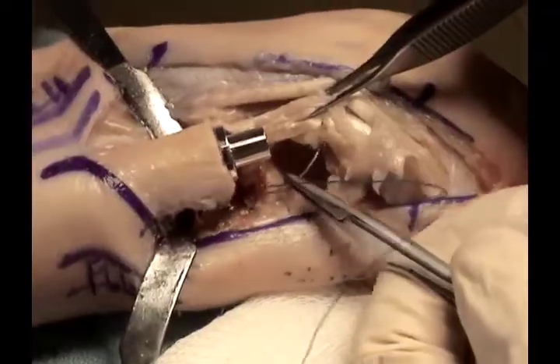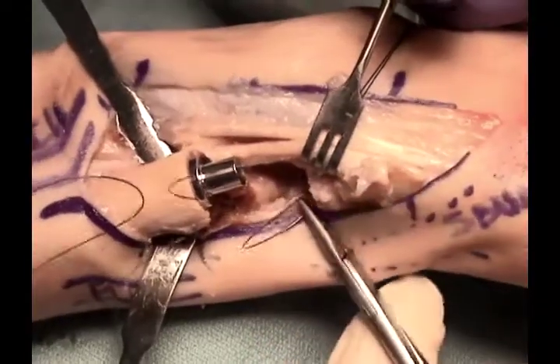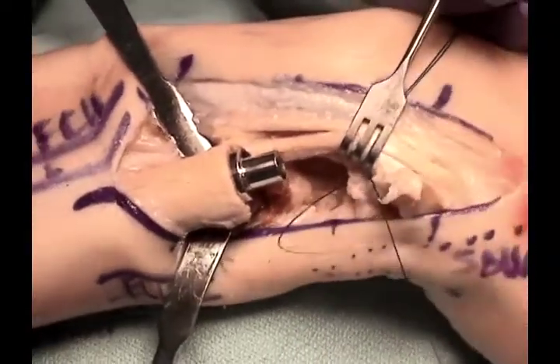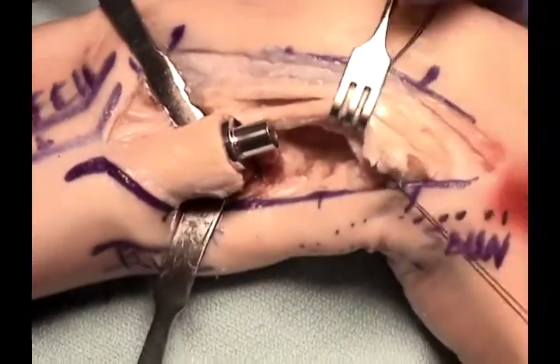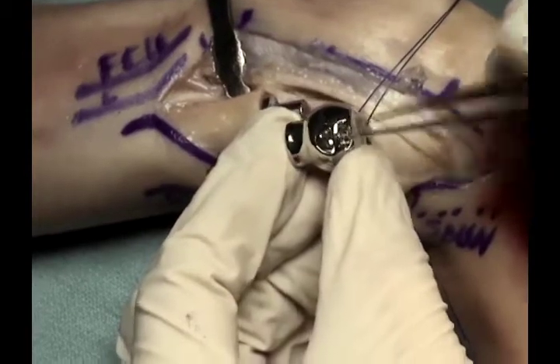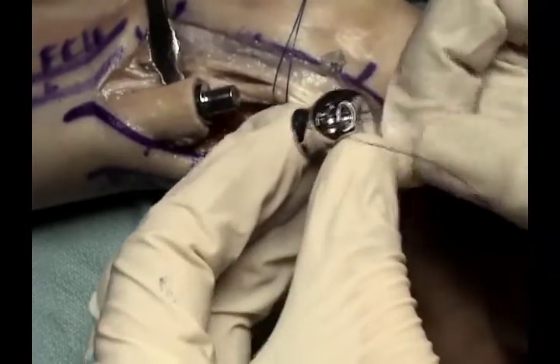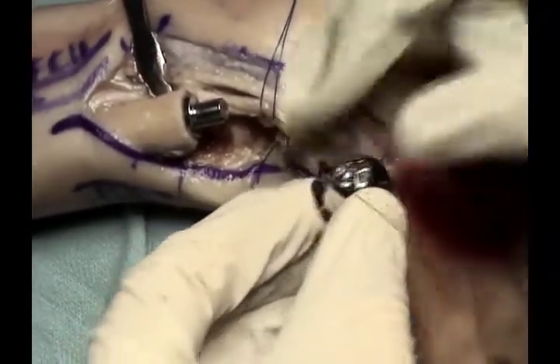Before placing the head on the stem, the sutures are first passed through the triangular fibrocartilage to anchor it to the head of the distal ulna component. This makes it much easier to pass the sutures through the eyelet holes in the head of the component rather than doing this after the head has been secured onto the stem.